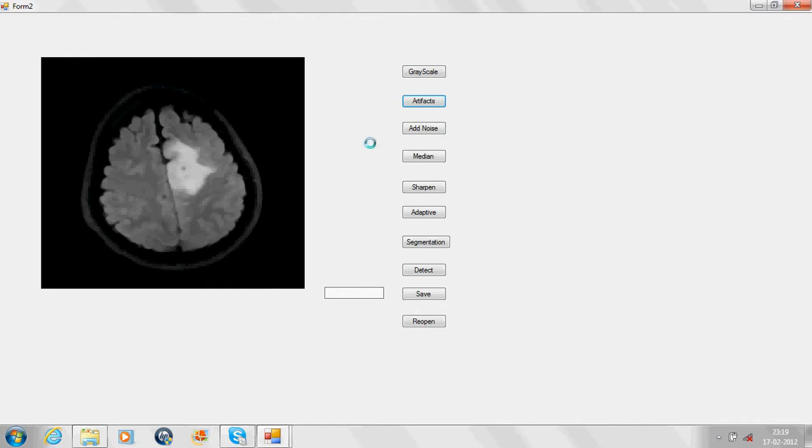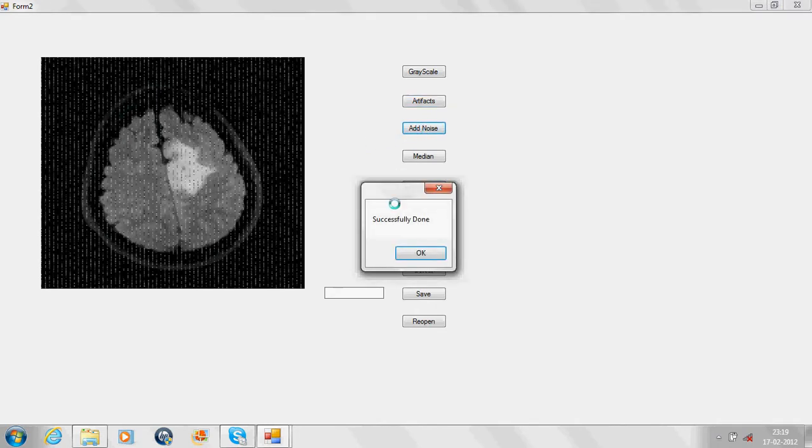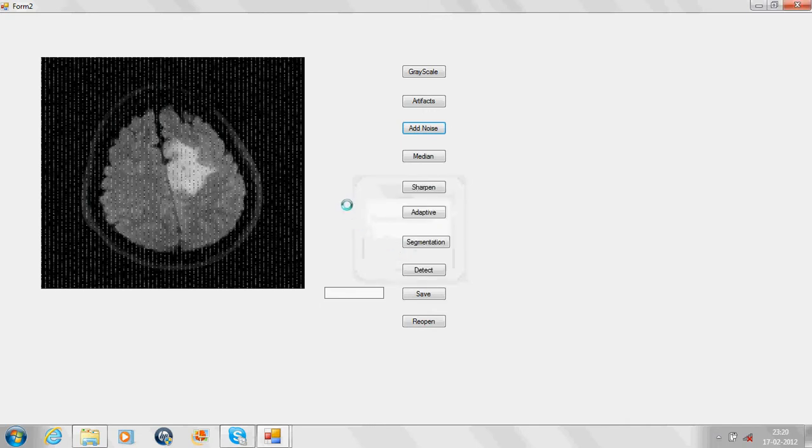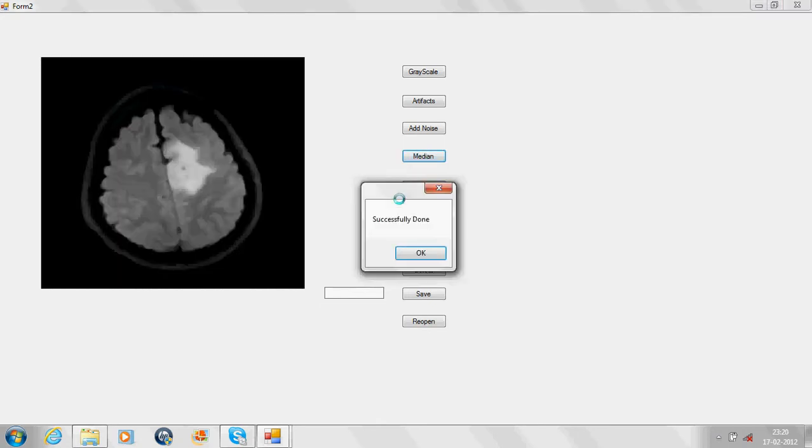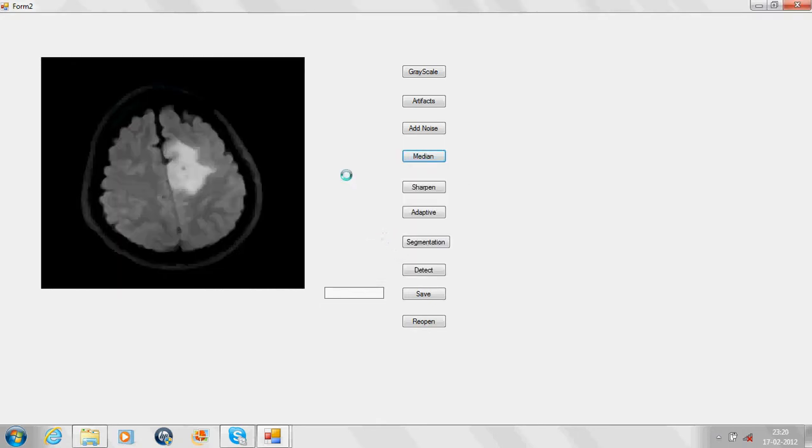The MRI image generally consists of impulsive noise, which is necessary to remove. In order to demonstrate removal of noise, we have added some noise. As you can see in the picture box, the noise has been added and will be removed through median filter. As you can see, the noise has been completely removed.